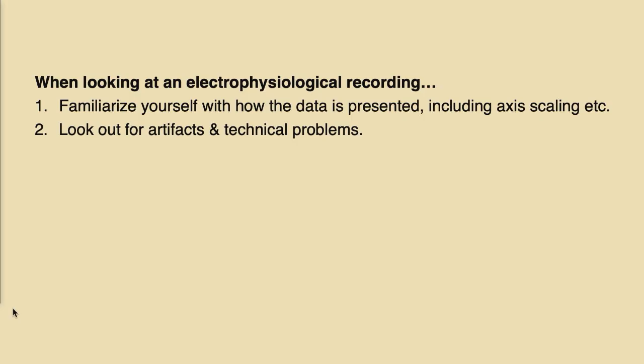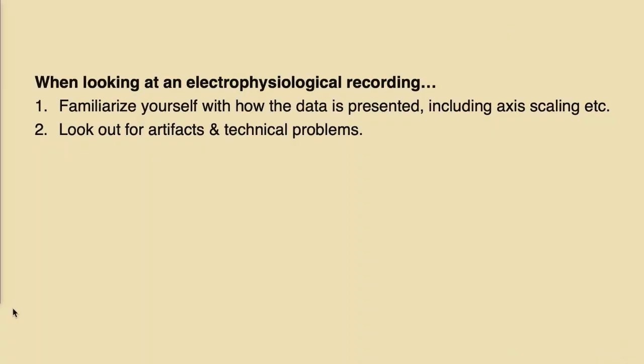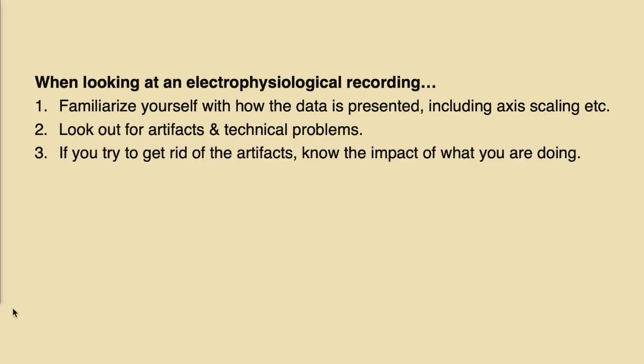The challenging part that you might not be able to do, and I understand that, is understanding the technical basis and therefore understanding the artifacts and the technical problems that might manifest in these curves. An important point is: is that clean data, or is there something in there that shouldn't be in there? And then, of course, the question of how to deal with it.